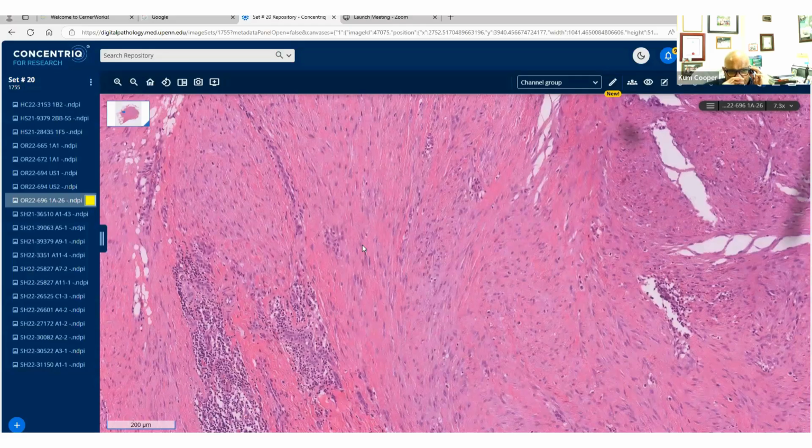Right. So the cytomorphology, I think, would not be in keeping with the epithelioid sarcoma. But if you did worry about it, and if you do, as I do, epithelial markers, then that should help you in that regard as well. CD34 should help you. And of course, if you have INI1, that's the ultimate way to rule out epithelioid sarcoma.